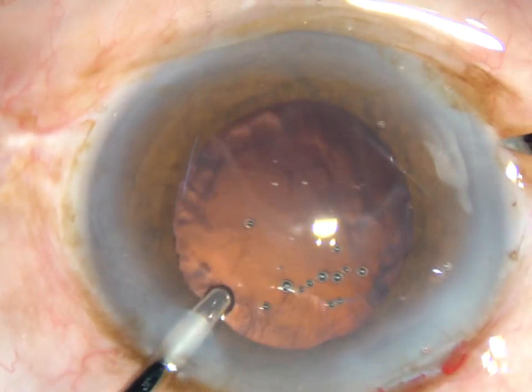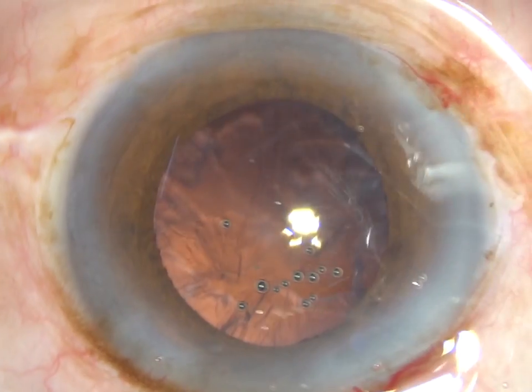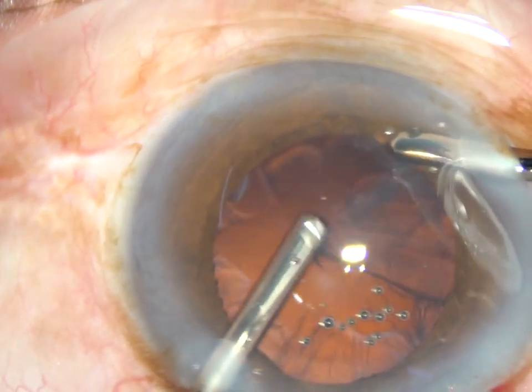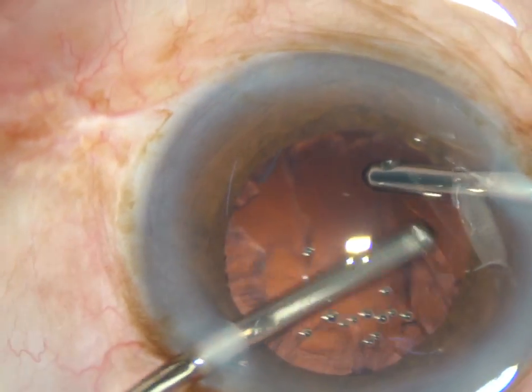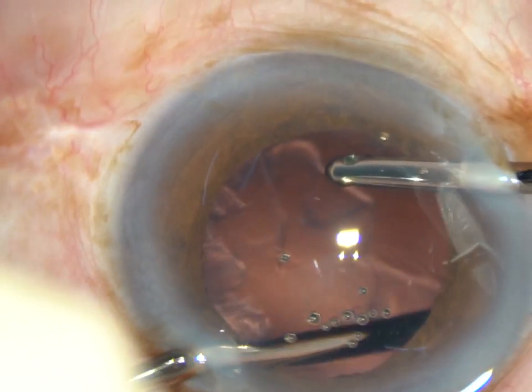Now I made only one side port, so here is another side port to use the bi-manual irrigation aspiration. Irrigation is from the right side and aspiration from the left. I am using 250 vacuum and 30 flow rate for irrigation and aspiration.